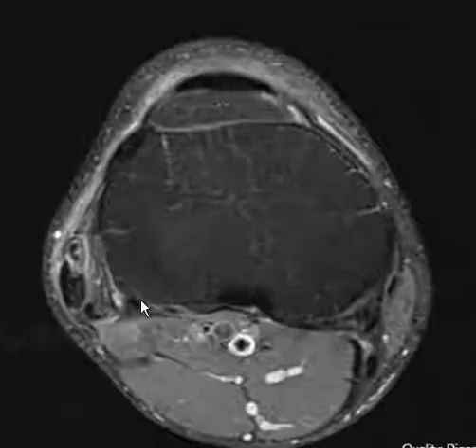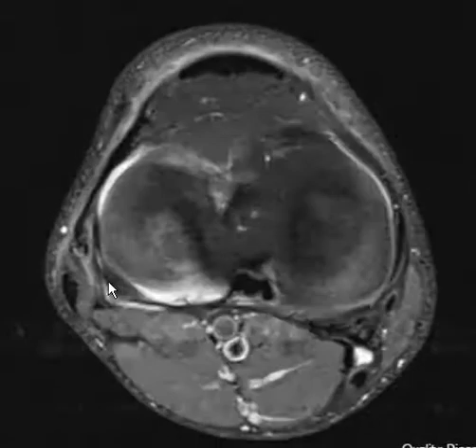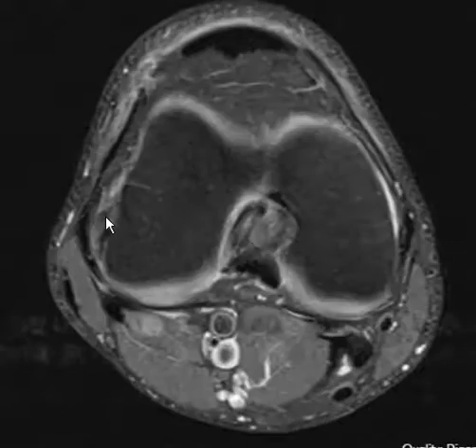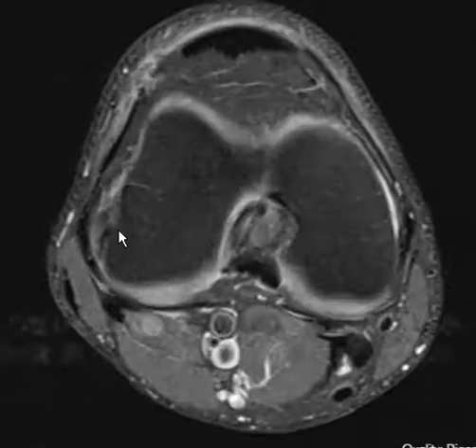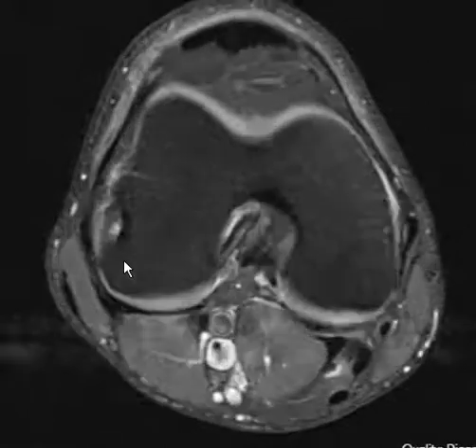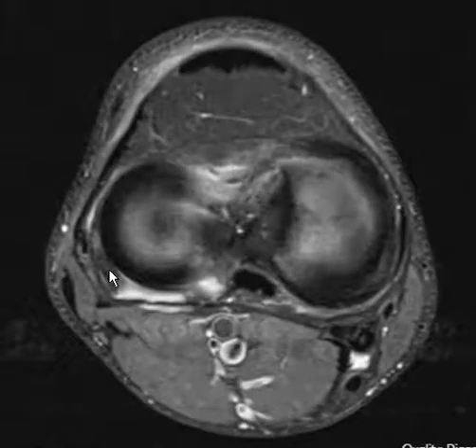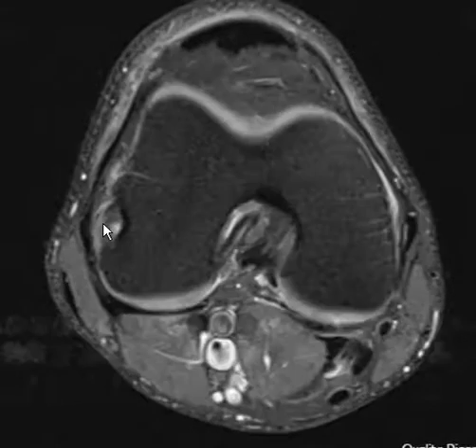Now the popliteus is really tough. Here is the popliteus muscle tendon — it swings around and goes underneath the fibular collateral ligament. When the FCL is torn, the popliteus can also be torn. The popliteus tendon is really difficult because it will often look gray due to magic angle phenomenon, making it challenging to determine whether a finding is real or artifactual.